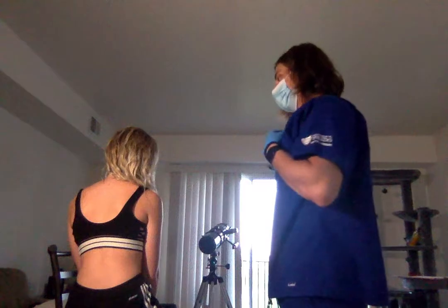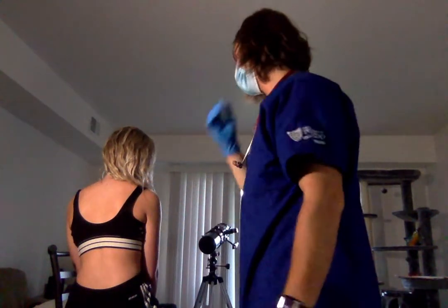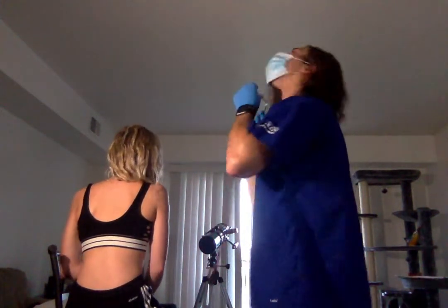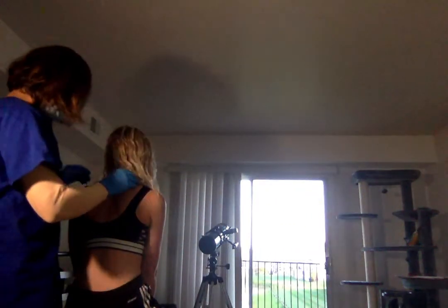Next, I'm going to check her posterior breathing. I'm going to do 10 positions, ending mid-axillary. I'm going to check your lung sounds. Okay. Every time I move, just go ahead and breathe in and out, okay?